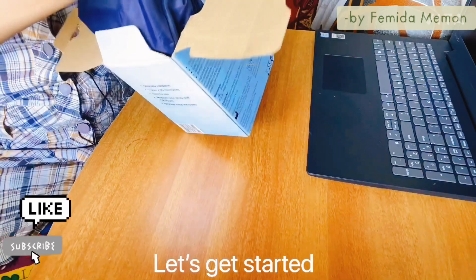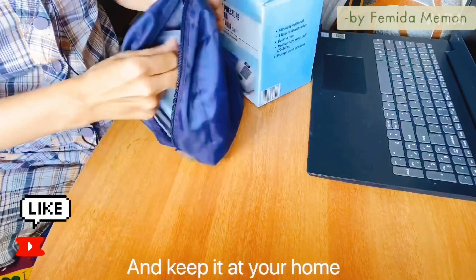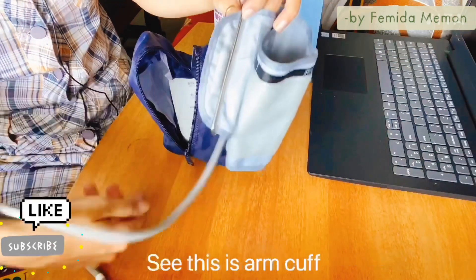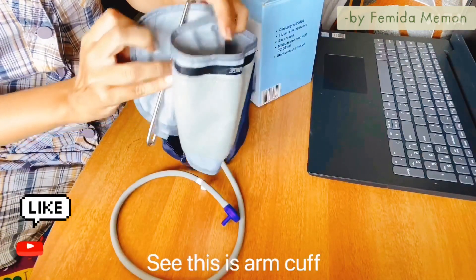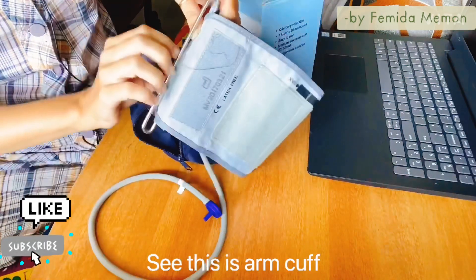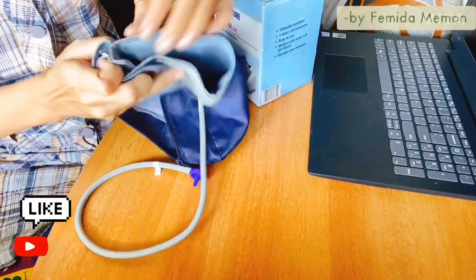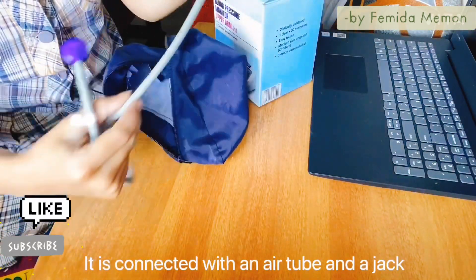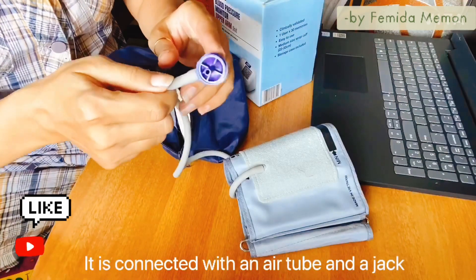Let's get started. First I will open the zip of this pouch — you can keep this machine at your home, anyone can purchase it. Here it is. This is an arm cuff, it is just like a belt with a velcro. It is connected with an air tube — see this long tube and an air jack, this blue one.